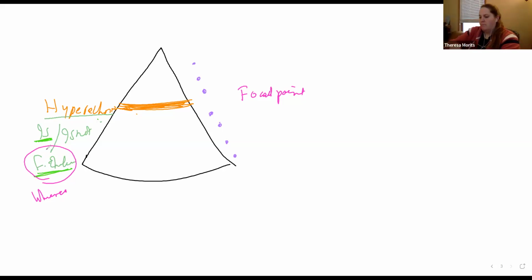Yeah. Good. Now my next question then. If you say that this here is your focal point, how on your system would you know that this is your focal point? Is it the banding? No. Because there's a marker where the focal point is, right?